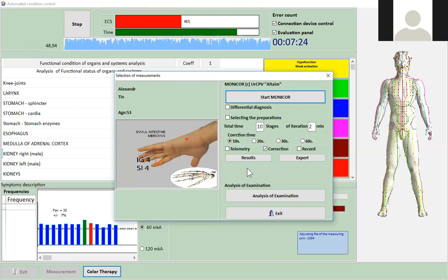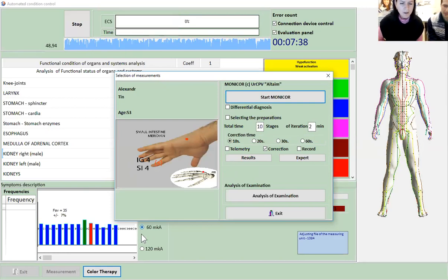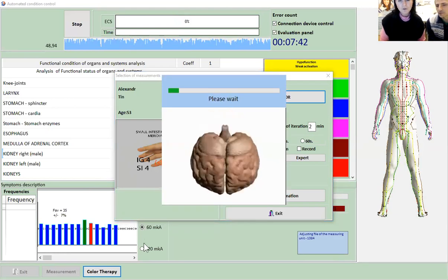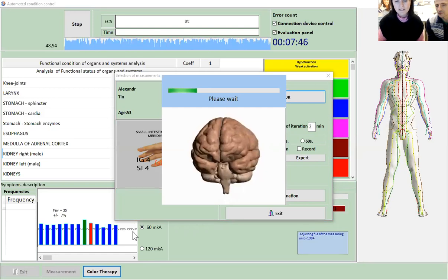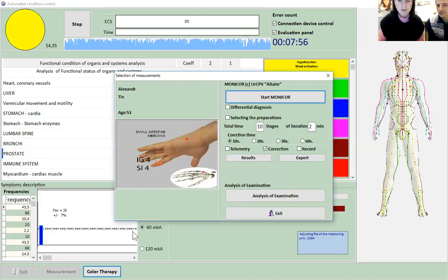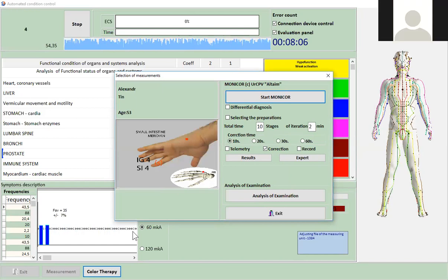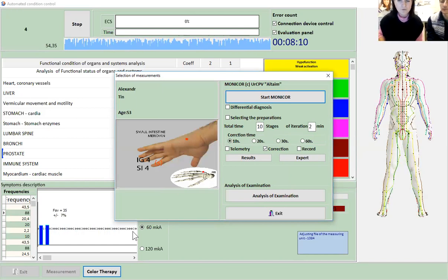On the bigger screen, what is the box on the bottom left with the blue bars and the green and the red bar? It says 60 MKA and 120. What's the MKA? Microampere. Before, you could also choose what level to work with: 30, 60, or 120. Sometimes you can be really sensitive, so you might work on 30 microamperes. But now it's decided to work on 60 every time, and you cannot change this anymore. Otherwise you have to reinstall all the different parameters, so people get confused. 60 microamperes is not too much.